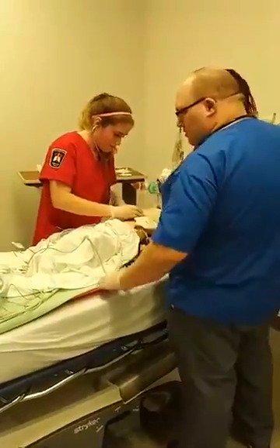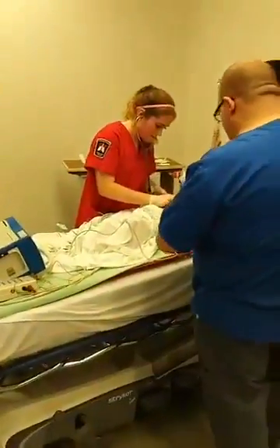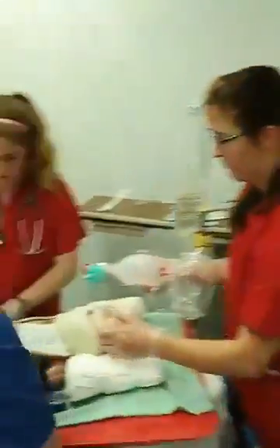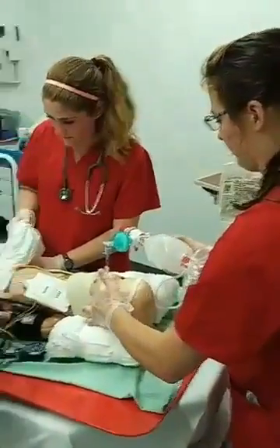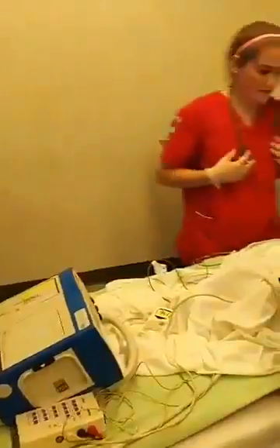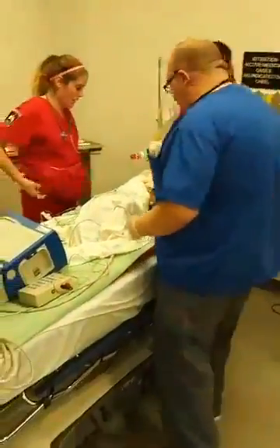And what else do you want to check there, Laura? So we need a blood pressure. Okay, great. Still getting bilateral air entry. Great. Does anybody have a hand on the pulse? How are the femorals? Strong. Strong pulse, yeah. Okay. So we've got our scan box, we have a drug box. Tube is secure. We're going to check our blood pressure, how are we doing? I got a blood pressure like 78. Oh, boy.